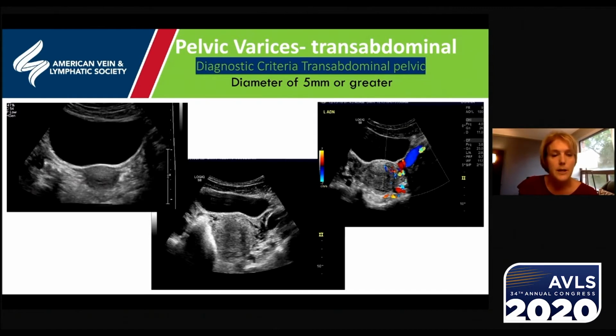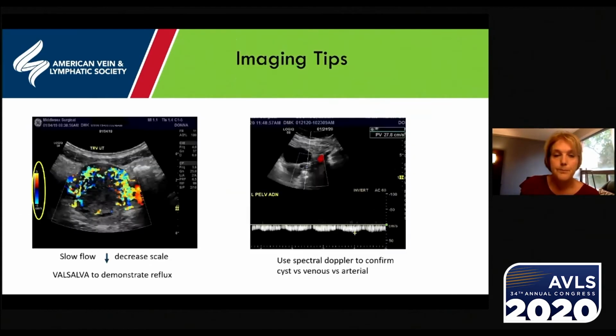The first image is showing an absence of enlarged veins. The middle image is showing what we know of as veins in that left adnexa and a few peeking out on the right side. I suspect with a different angle, we would see more veins on that right adnexa as well. And then there's a color flow image demonstrating flow within those veins.